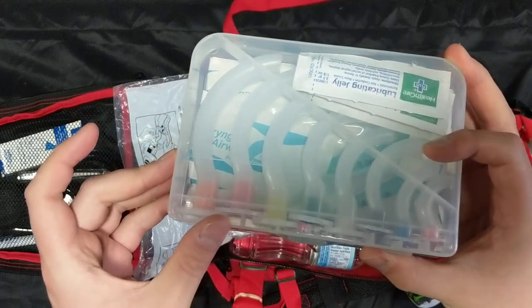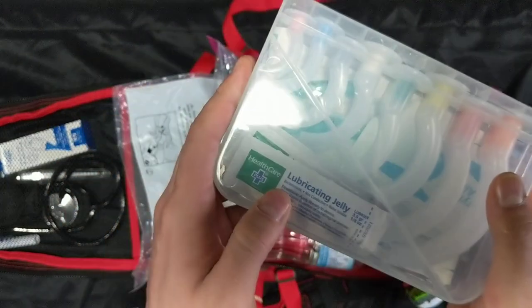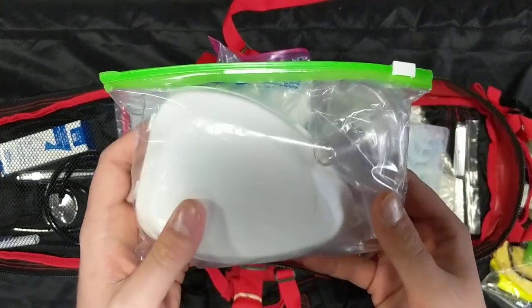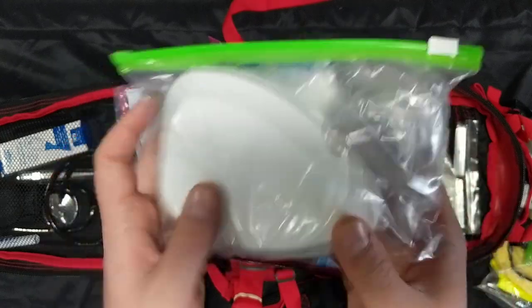Then you have an airway kit with eight oral pharyngeal airways and three nasal pharyngeal airways, as well as lubricant for those nasal pharyngeal airways.